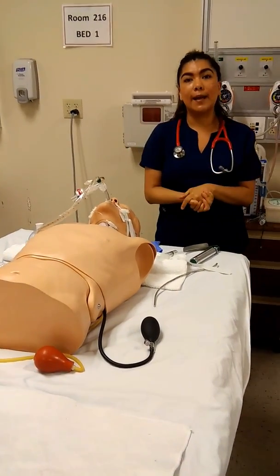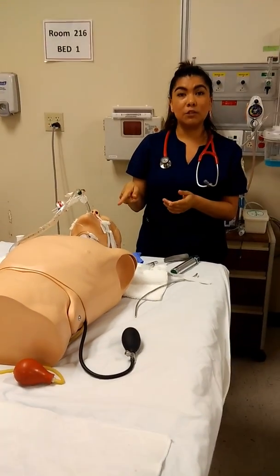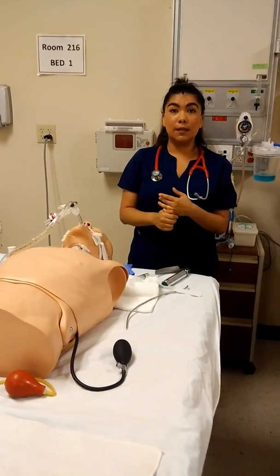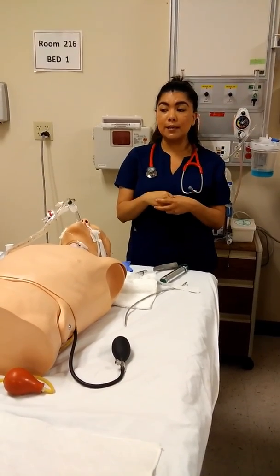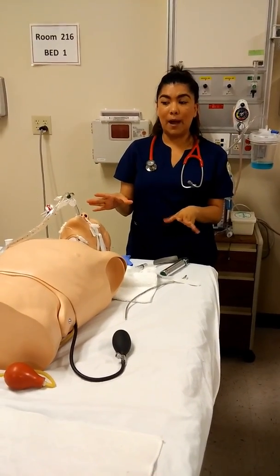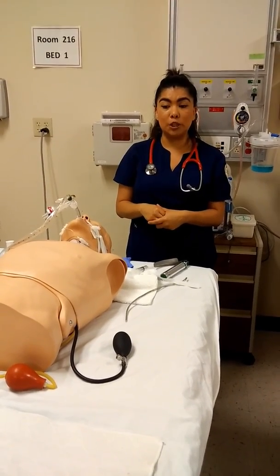Then we're going to go ahead and document, and we want to document the placement of the tube, where it was at the teeth, whether it was a difficult intubation, and then of course we want to order the x-ray again to check the 3 to 5 centimeters above the carina, and then in case there were to be an ABG order, we want to wait half an hour after the patient was intubated so that we could go ahead and proceed with the ABG.